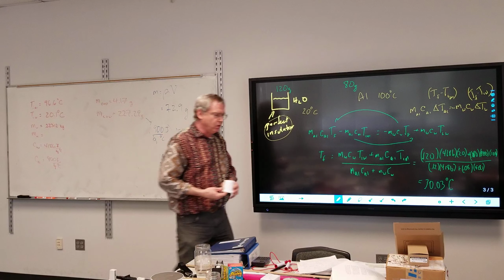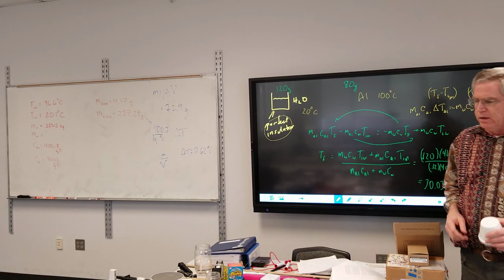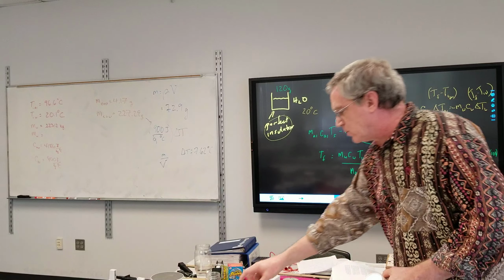I did not grab one with a hole, so I will make a hole. We need to make sure that transfer happens as quickly as possible.